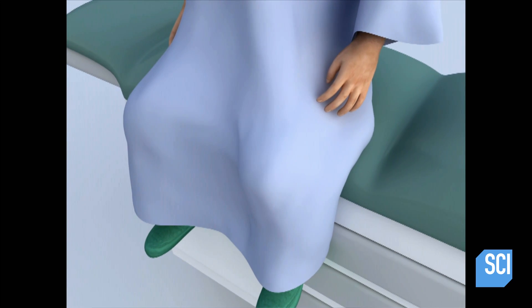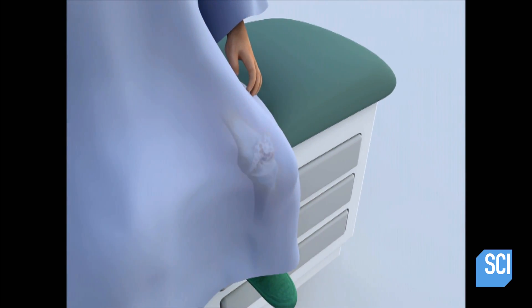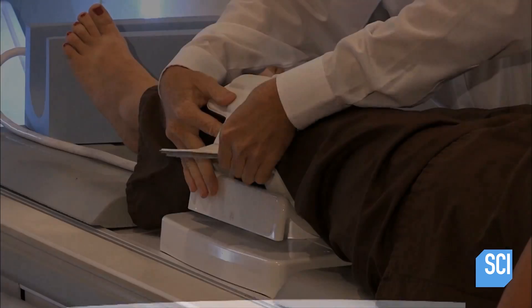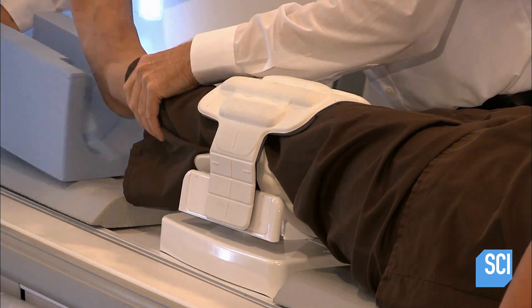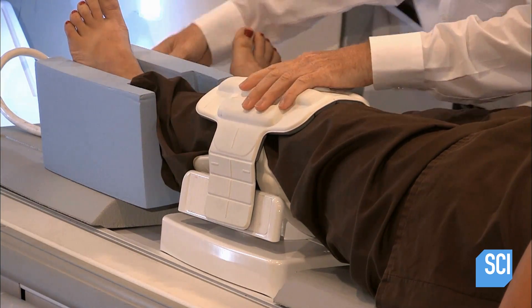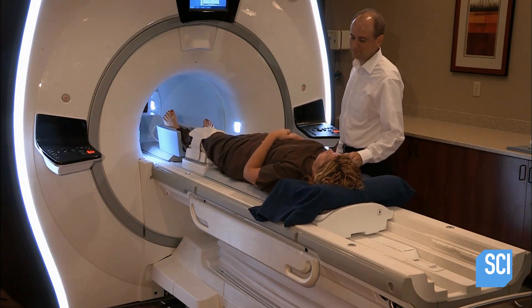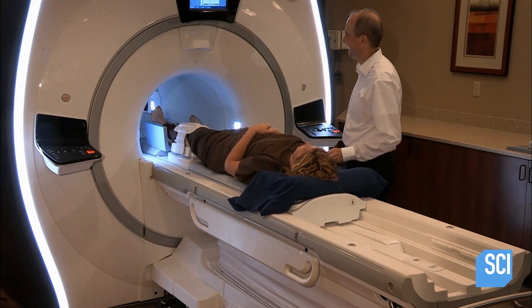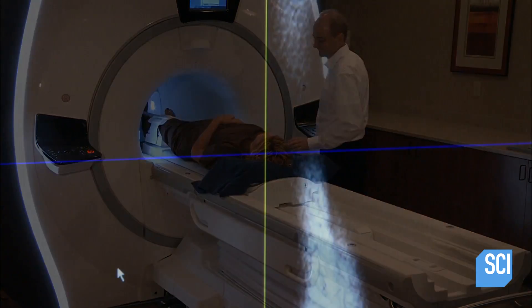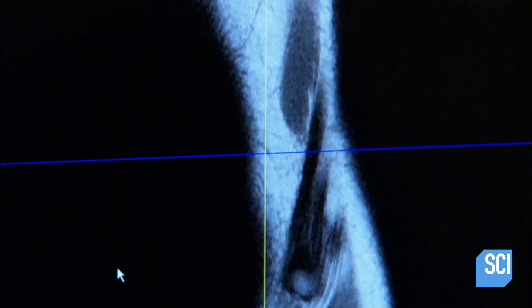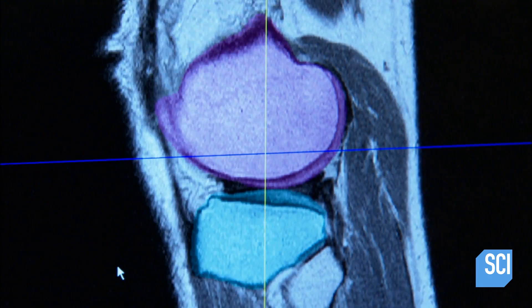A successful knee replacement depends on its alignment with the femur and tibia, the upper and lower leg bones that connect at the knee. That's a challenge because knee implants are standard, while every patient's bones are unique. So starting with an MRI scan of the patient's knee, this medical device company produces custom-made surgical templates — plastic devices the surgeon uses to sculpt the surface of the patient's bones to align the knee implant accurately.